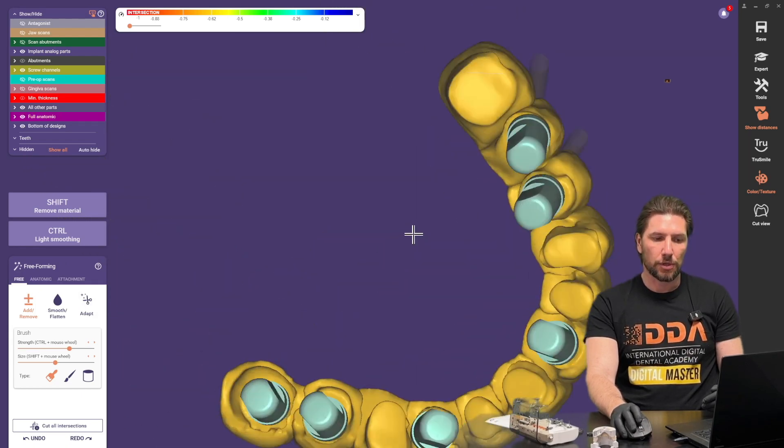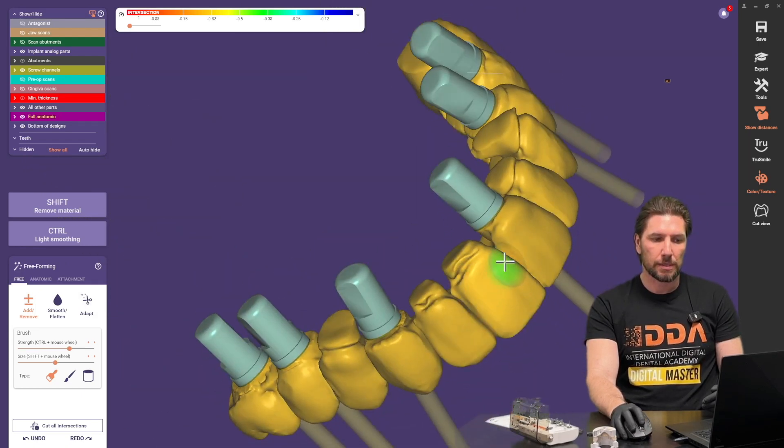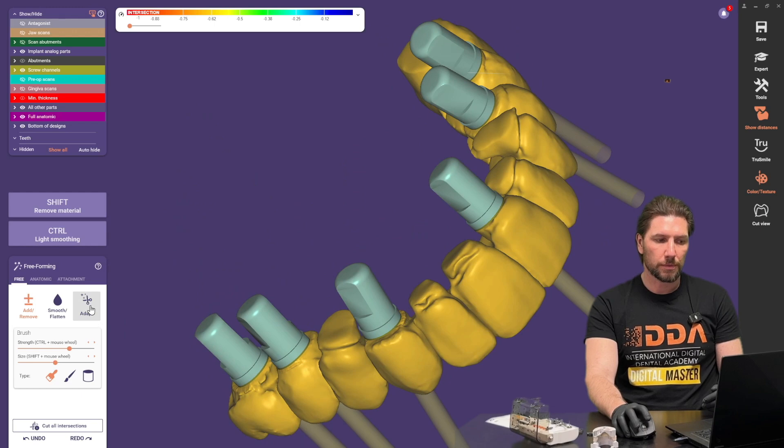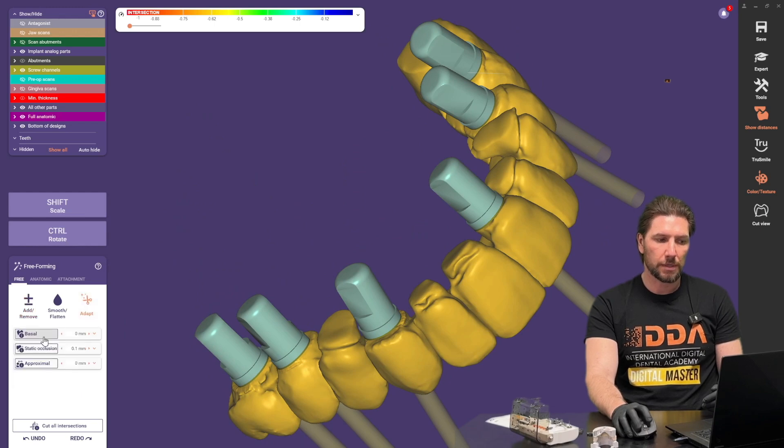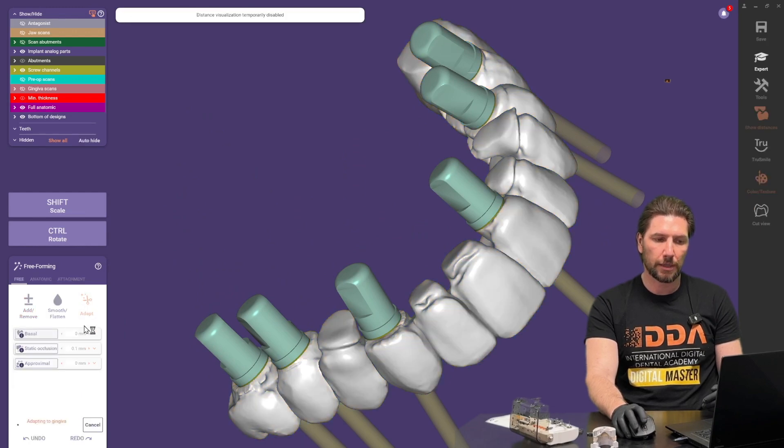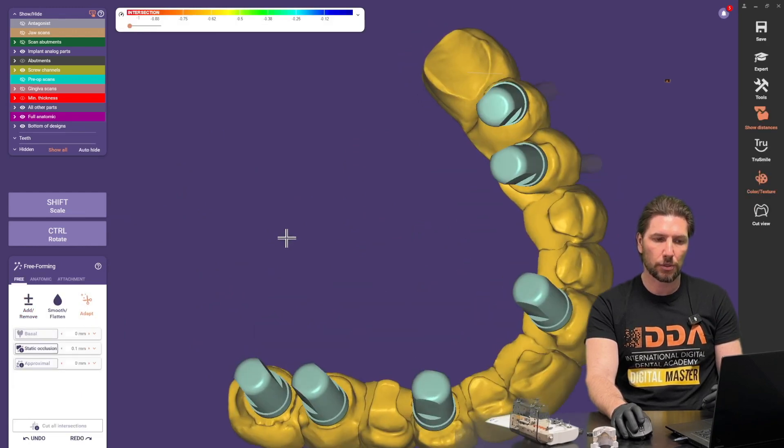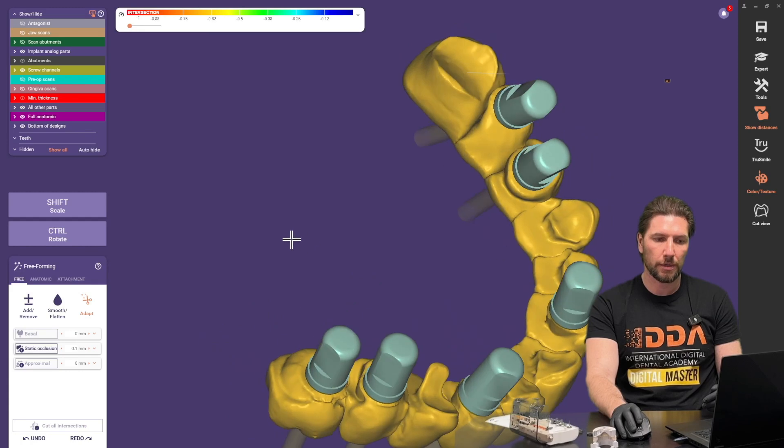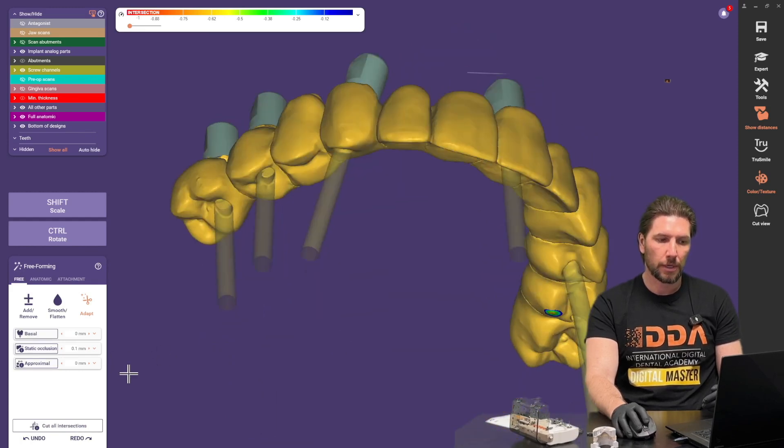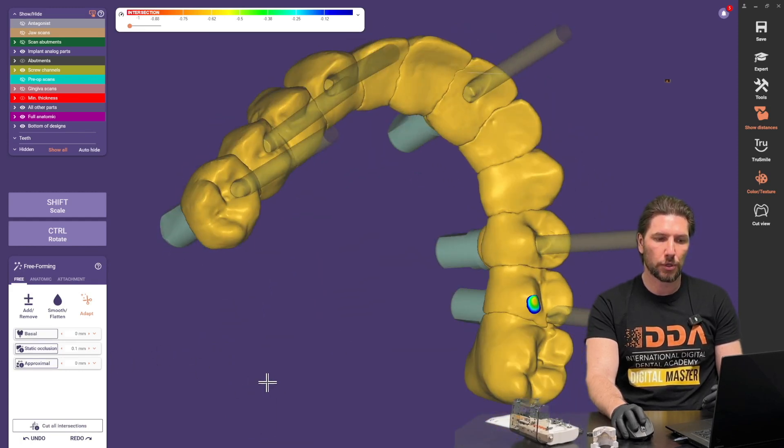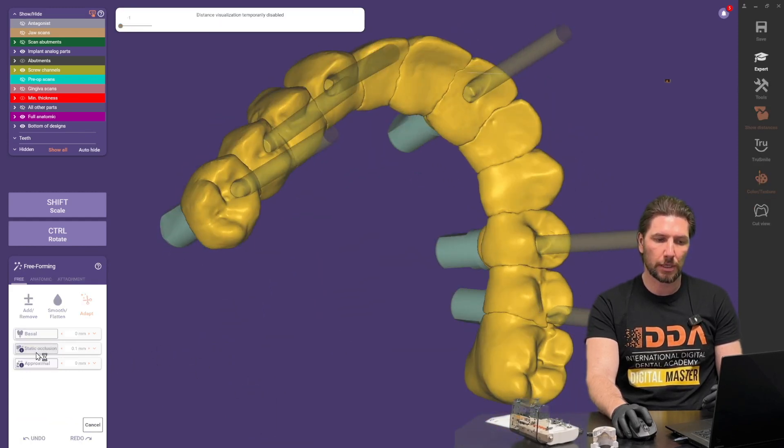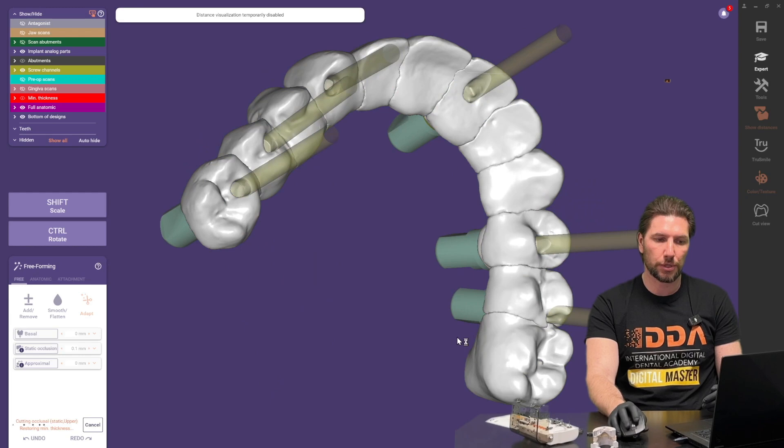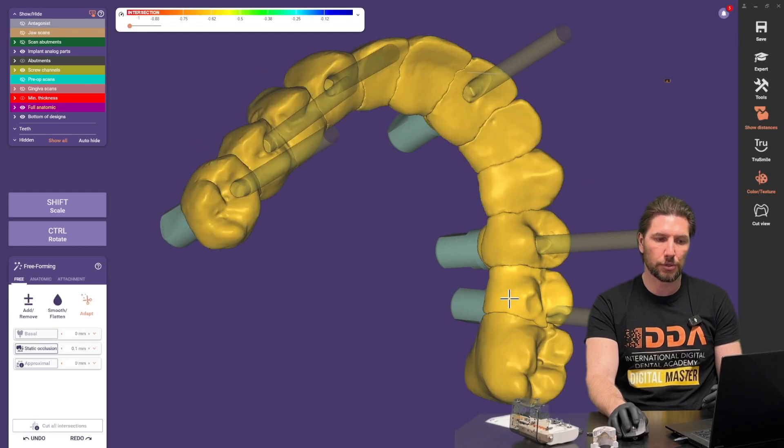Now the base of this you can see is sitting below the gum to make our lives easy we're just going to click that basal adaptation and that's going to cut that away ready for us to smooth out. If we want to adjust the occlusion then we can click static occlusion and again it'll adjust that there.